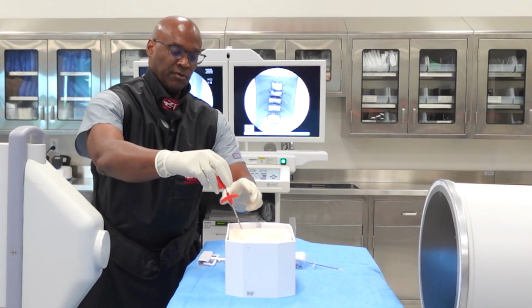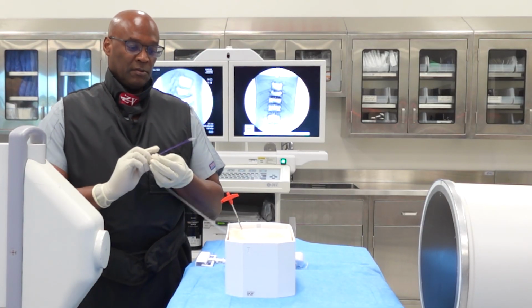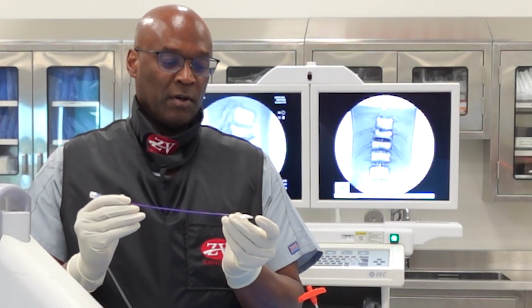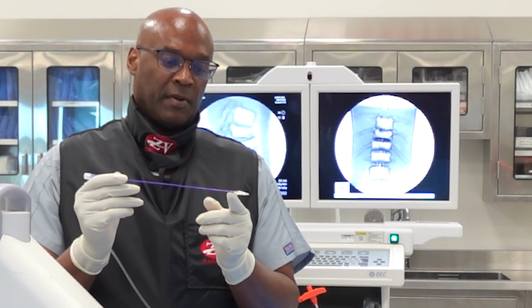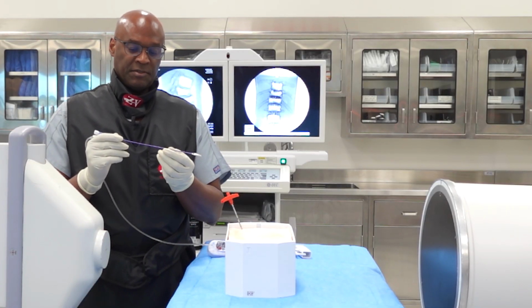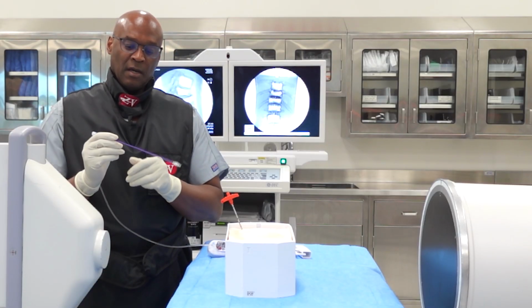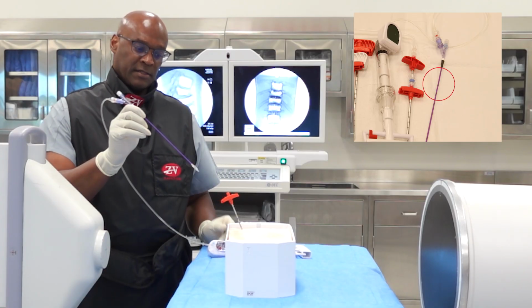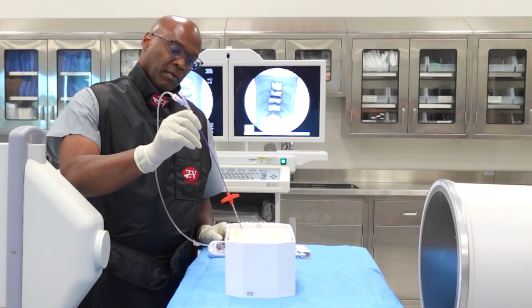We take the drill out, and we pass the balloon in through the jamshidi. Now, what's important is there's 2 markers on this balloon that are radio-opaque, one at the tip and one at the back portion. You want to make sure that that's past the end of the jamshidi needle, because you do not want to inflate this balloon inside of the jamshidi. There's another black laser marker on the end of the tip, which gives you a guide as to how far in you are with the balloon.